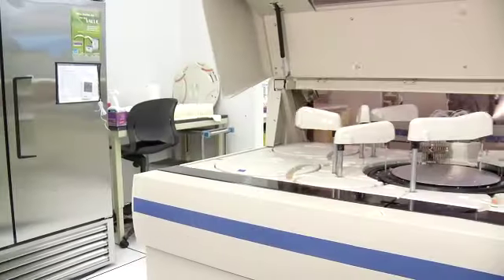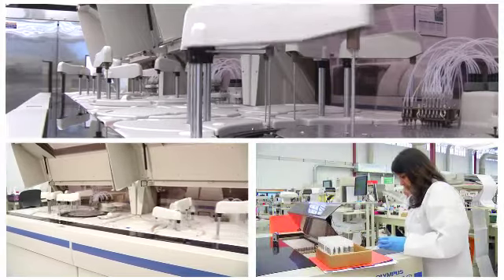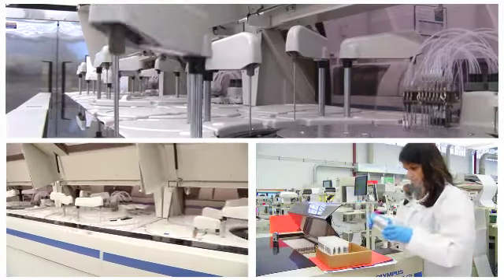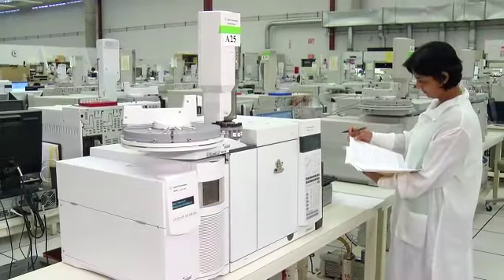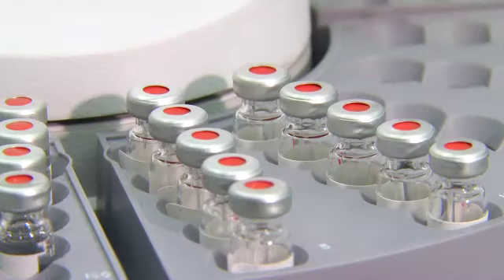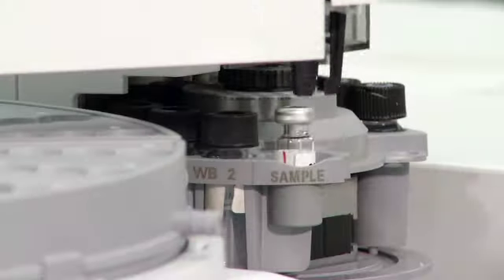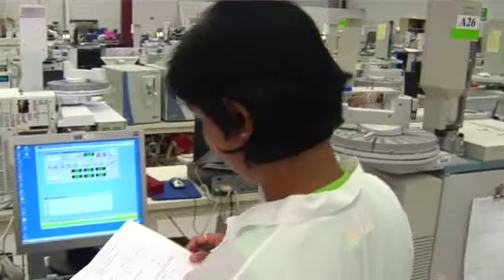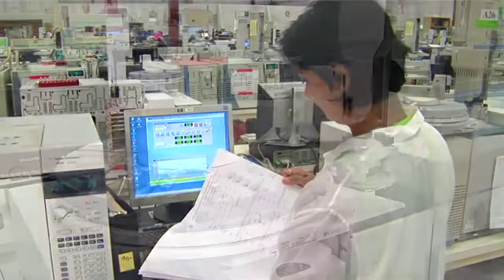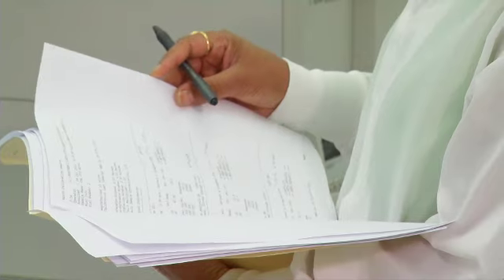Specimens undergo a two-tiered testing process. First is the initial screening, which is done on one portion of the specimen and is designed to rapidly isolate negative samples from those which need additional testing to confirm the outcome. The next step in the process is the confirmation test on a second portion of the specimen, which uses definitive methods such as gas chromatography, mass spectrometry, GC-MS, that specifically identify and quantify the drug or drug metabolite in the specimen. When a drug or drug metabolite is identified at a concentration equal to or above the administrative cutoff, the result is reported by the laboratory as positive.